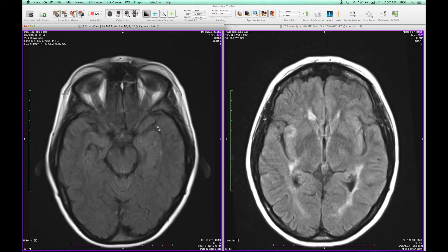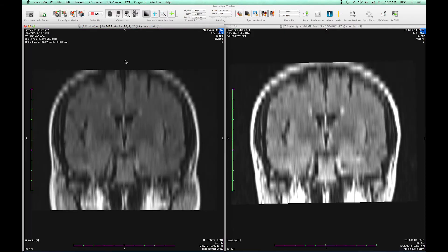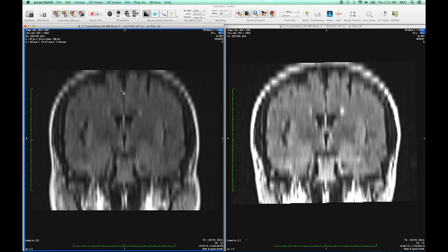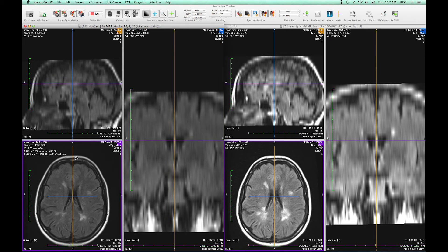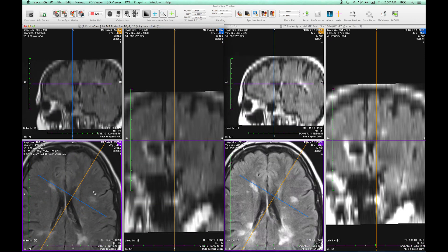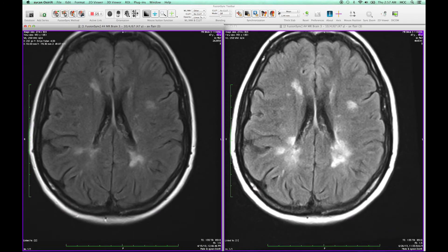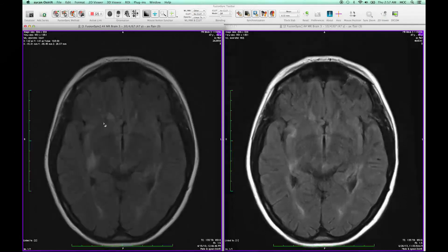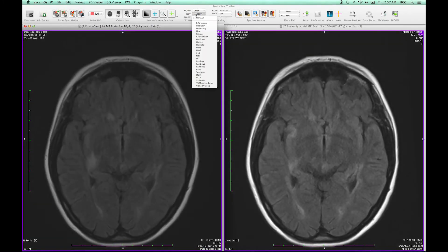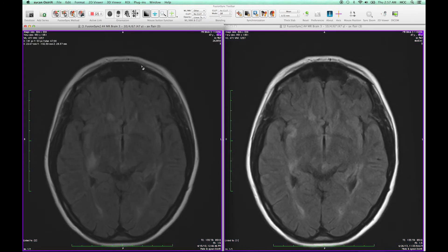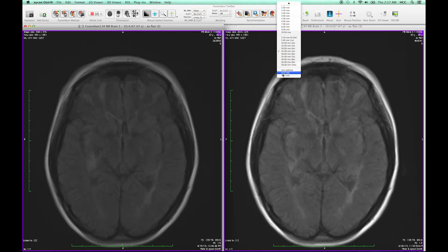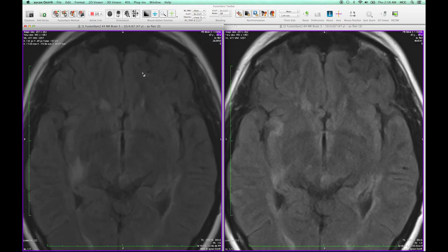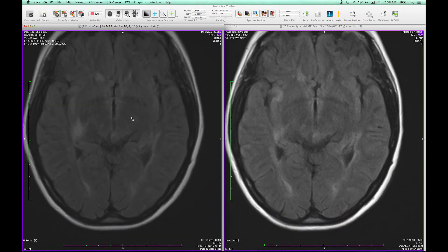You can then freely navigate within the viewers and each interaction is propagated to the linked data in the other windows accordingly. This is done in 3D as you can see. This will incorporate the spatial position and orientation, but also the viewing settings like the window level width, the color lookup table, the rendering properties, and the orientation like zoom, spatial position, movement and so on.